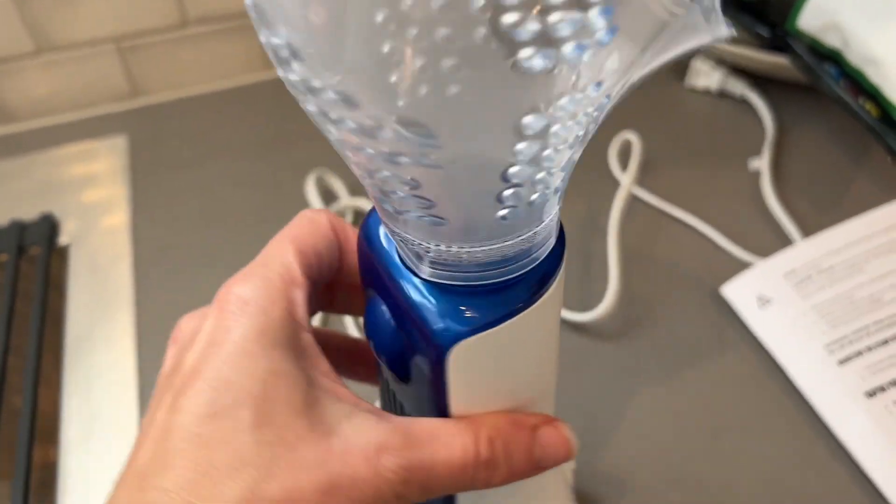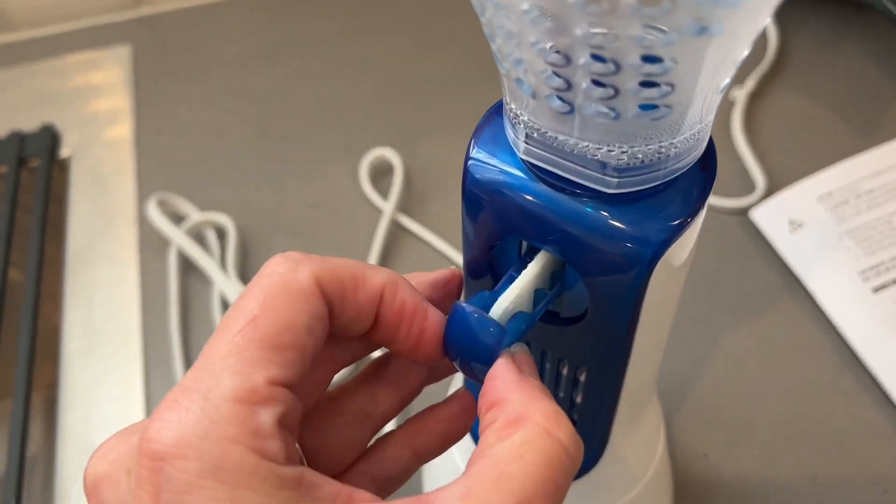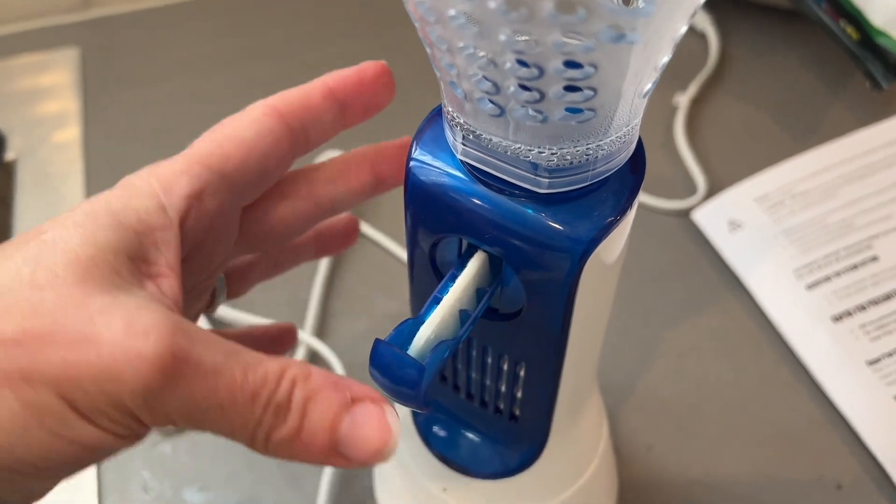You are supposed to change the vapor pads for each session, so when you're done, you take that out and throw it away.